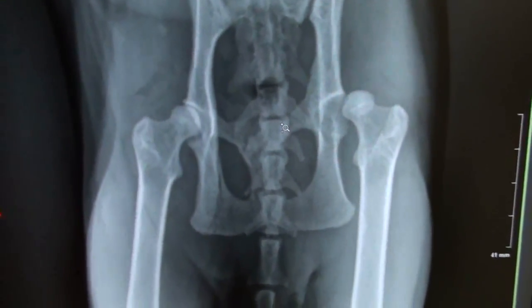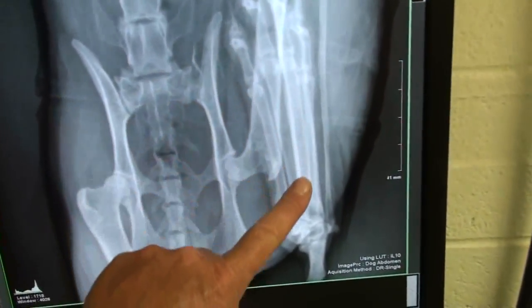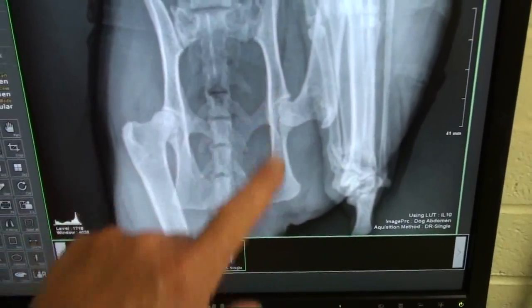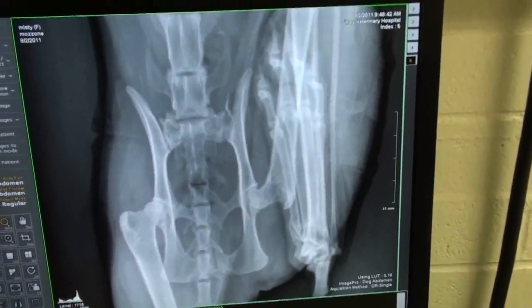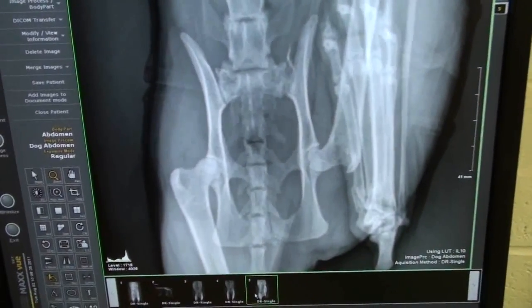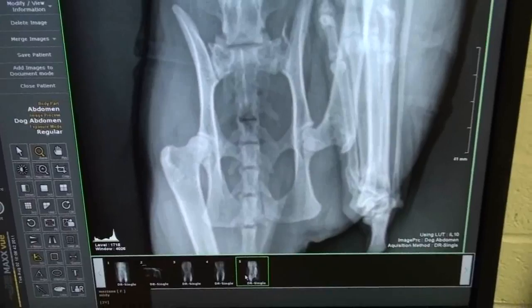I'll show you what that looks like. So now one leg is down like this and one leg is up and wrapped. When you pop it in, you can see the ball is now in the socket. It has to stay there for a couple of weeks. Cats are great — they really do well. Even if you were to leave it out, some cats just form a false joint and actually do fine. But it's always better if we can get it where it's supposed to be.